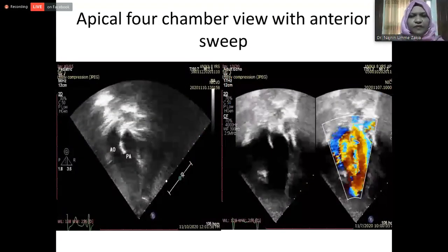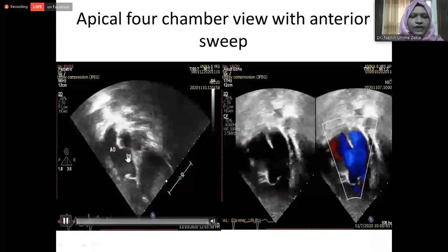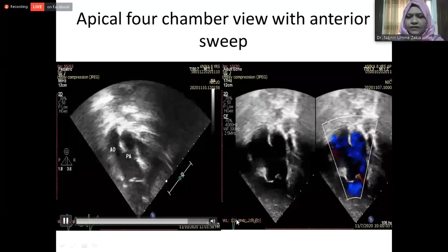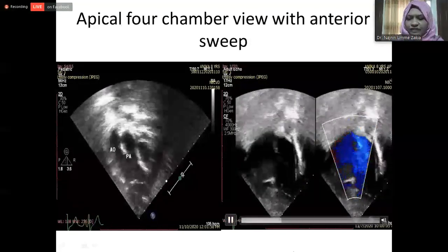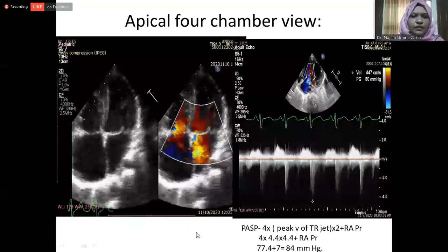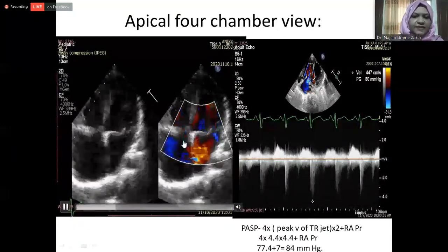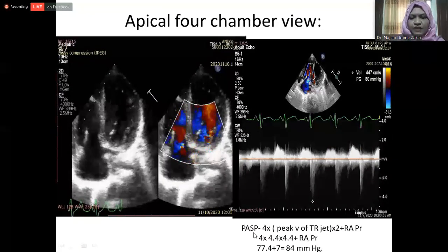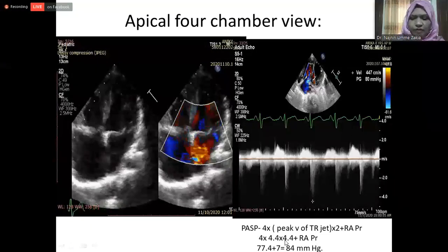This is the apical four-chamber view with anterior tilt. We can see the aorta and pulmonary artery, and the gap in the aortopulmonary septum close to the pulmonary valve. Color flow interrogation shows laminar continuous flow through the defect. The apical four-chamber view also shows mildly dilated LA and LV with trivial mitral regurgitation, but there is significant tricuspid regurgitation.